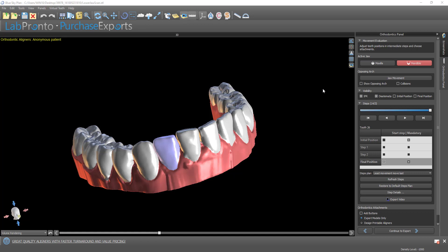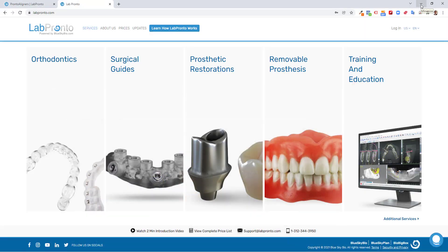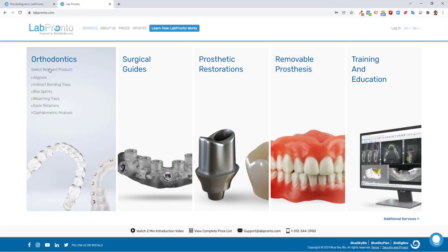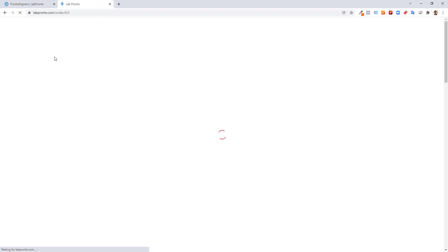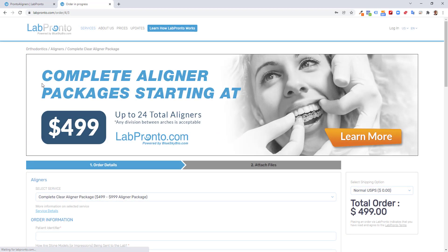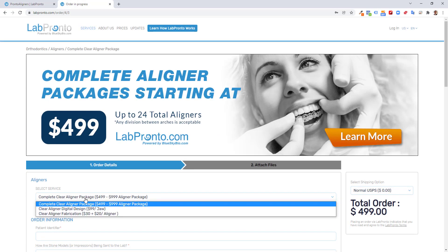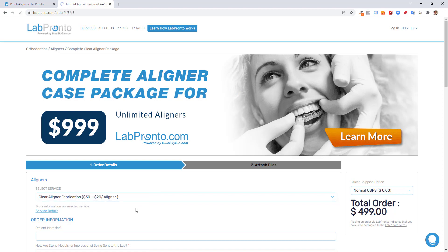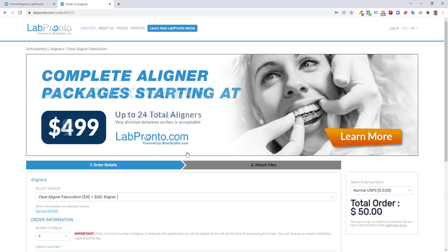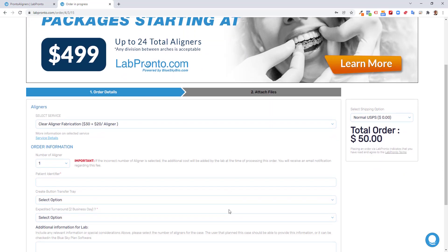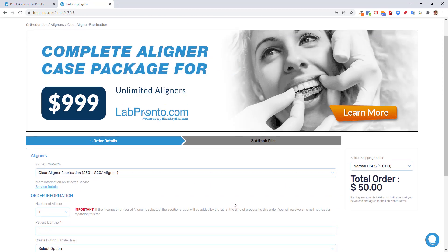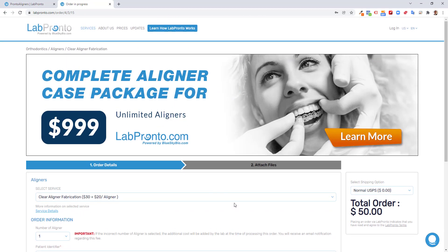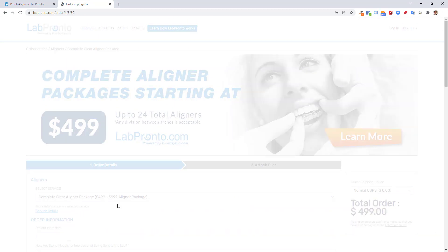You could continue designing the case. You could manufacture the aligners in-house if you design the case and want to get help manufacturing the aligners. And of course, we always have Lab Pronto. You click on orthodontics aligners and choose the option for clear aligner fabrication. And you could place your order just by uploading your Blue Sky Plan plan and have the aligners manufactured for you.